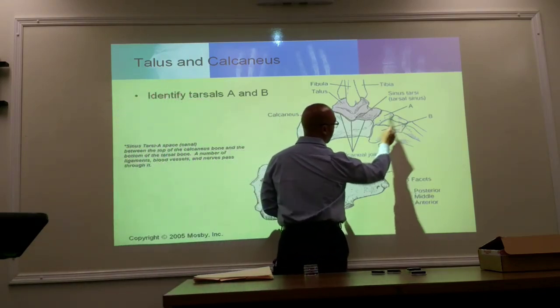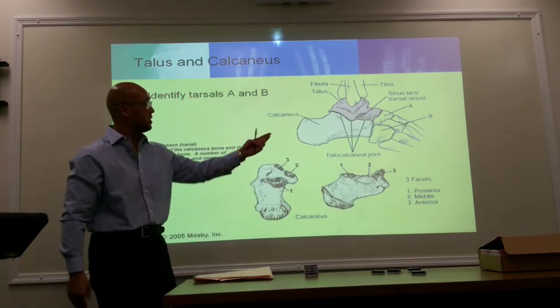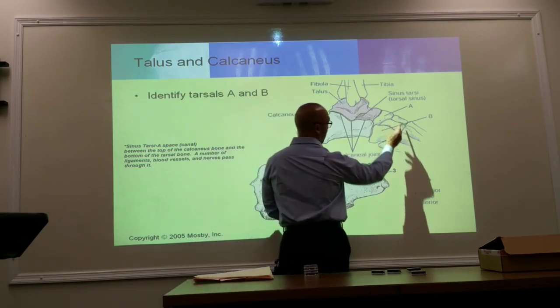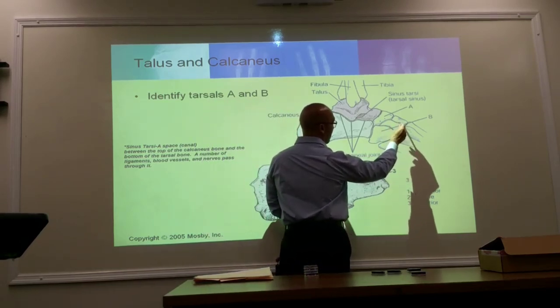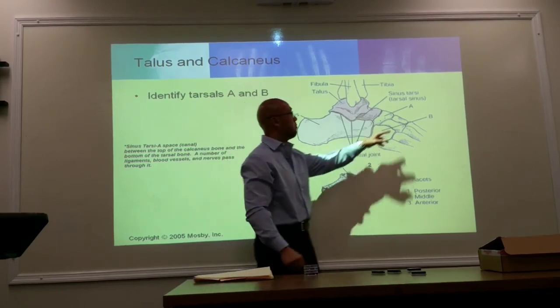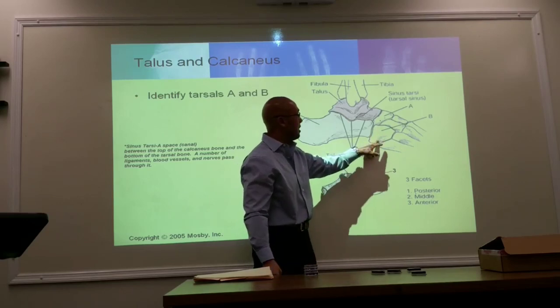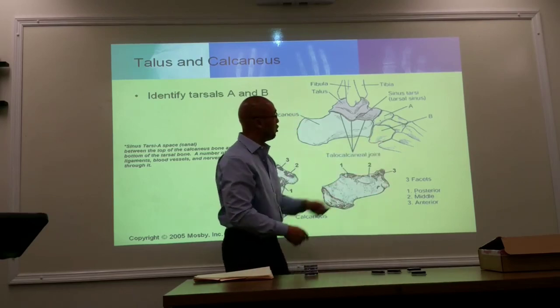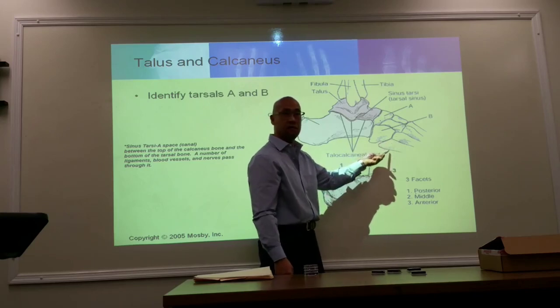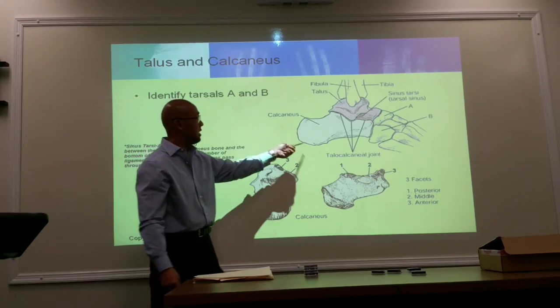So these are the cuneiforms that are superimposed. You can only see 2 and 3 here. One is going to be right behind it. Okay, so this is 2 and 3, and right behind that is going to be cuneiform number 1. So in back of that is going to be the navicular. In back of the cuboid, and we know this is the cuboid because of the articulation with 4 and 5, right behind that is going to be your calcaneus.